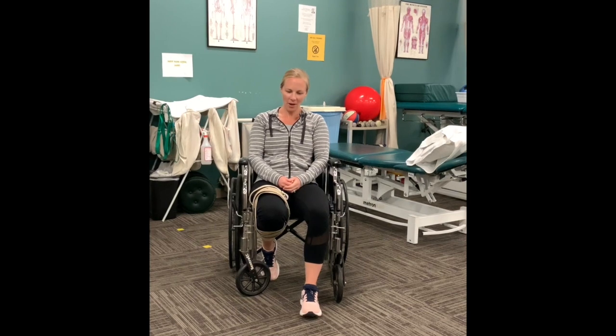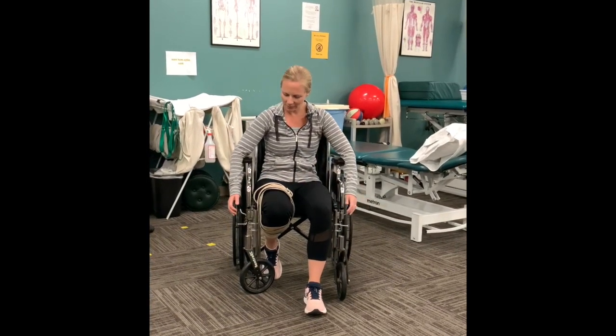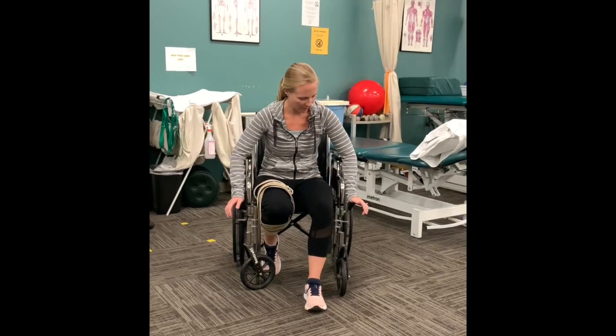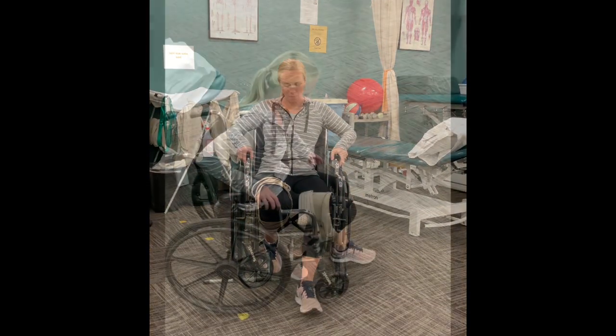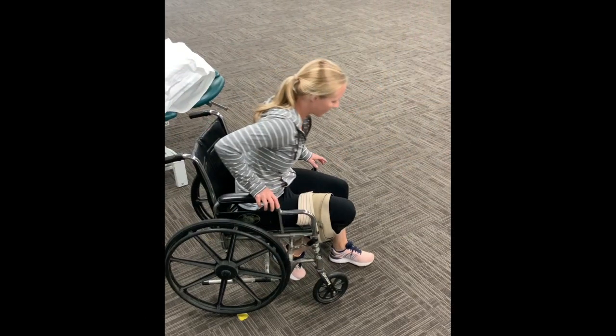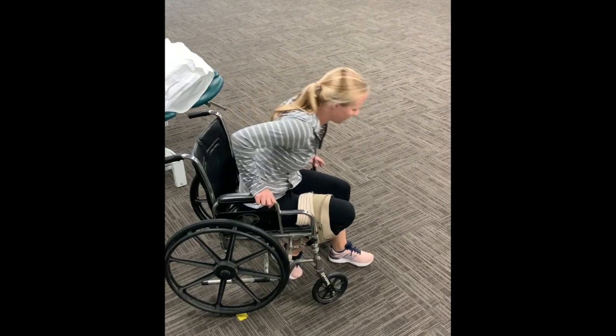In order to ensure safety, the patient must first apply the brakes on the wheelchair. Next, the patient will scoot forward towards the edge of the wheelchair and position themselves at a slight angle towards the residual limb side. Then, they will place their sound limb firmly on the floor and with the trailing hand, grab and hold onto the frame of the wheelchair.